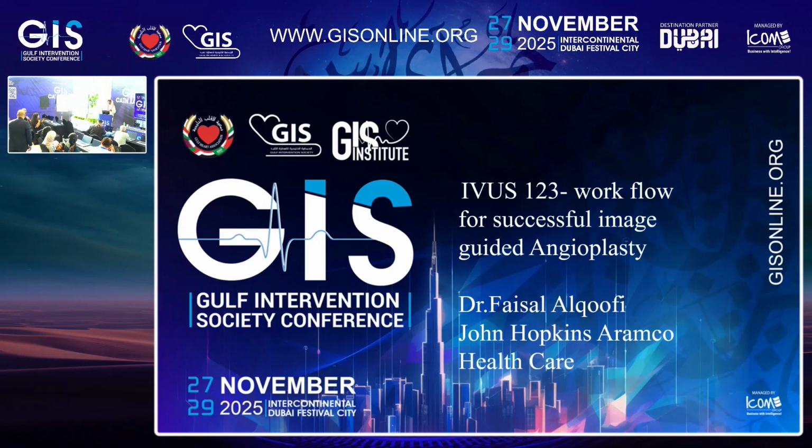Now, Boston came up with a very nice workflow, and as you notice, for all imaging, now we are moving toward what we call actionable imaging, where you have a clear workflow, clear steps throughout the way to make sure that you do not miss anything, and the communication among the cath lab staff is very clear. So the workflow we're going to discuss is IVUS 123.